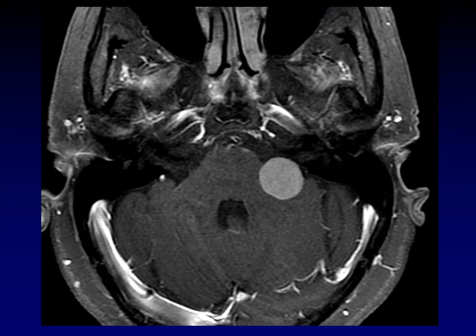Be a little bit careful when you're dealing with this broad-based against the underlying bone scenario. There is no way you could think that this is broad-based. This thing is floating out in the cerebellopontine angle cistern. It's not even touching the bone, so you might be inclined to call this a vestibular schwannoma. But look how uniform that enhancement is. That is perfectly uniform. And so that should raise some questions in our mind.